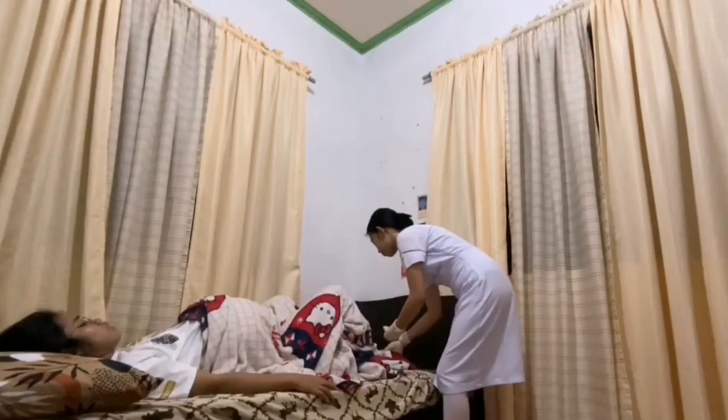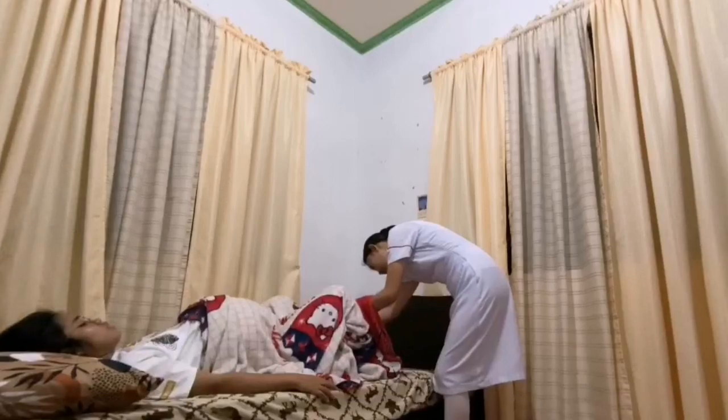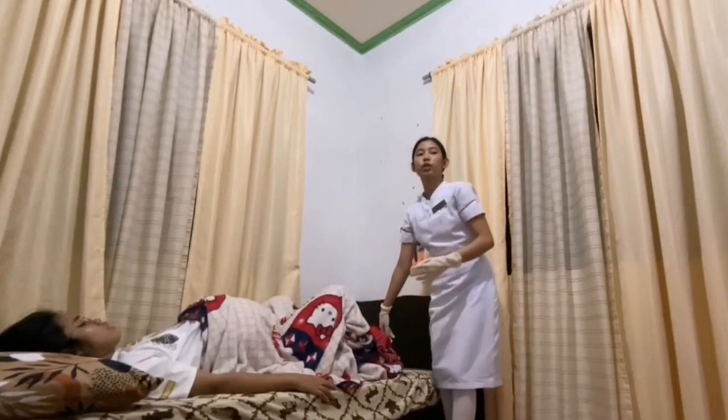So, ensure controlled delivery of the head. Keep one hand gently on the head as it advances with contractions. Support the perineum with the other hand and cover the anus with a pad held in position by the side of the hand during delivery. After that is to leave the perineum visible between the thumb and first finger.